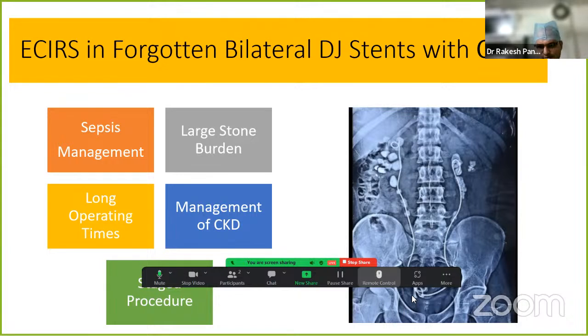We have to take help of, as you told while discussing, URS and cystolithotripsy, then both antegrade and retrograde access is required. In supine PCNL, we can do it. We can do PCNL and from below we can clear the stone. If possible, in a single stage also we can clear it if the patient is stable, or else we have to stage the procedure.